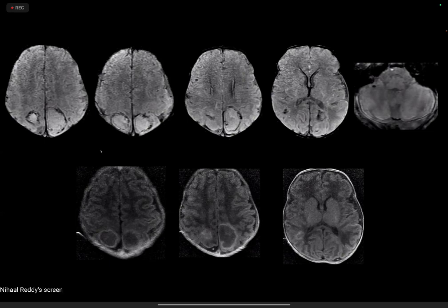Do you have cortical highlighting on that T1 as well, the last picture? Or am I imagining it? It's going up to the cortex, but yeah, the last one, the third along that. So it looks more bacterial. That's what I'm saying. Yeah, that's what I thought. But CSF is completely normal, so I was still.